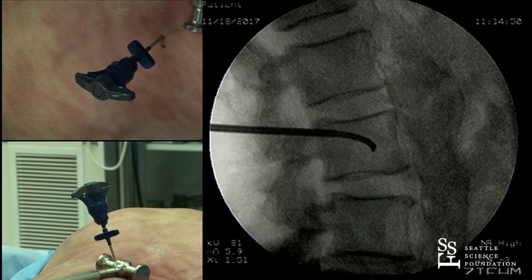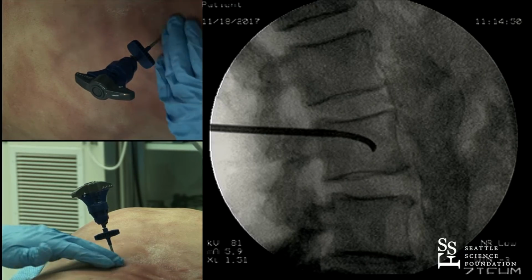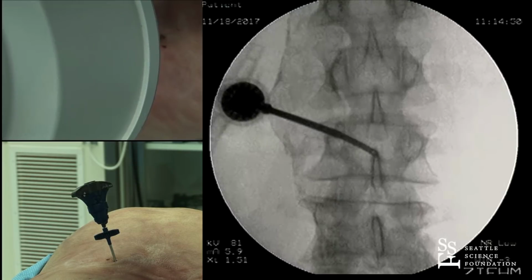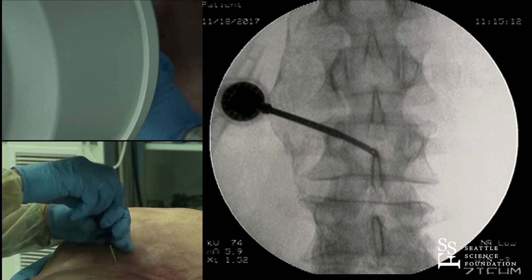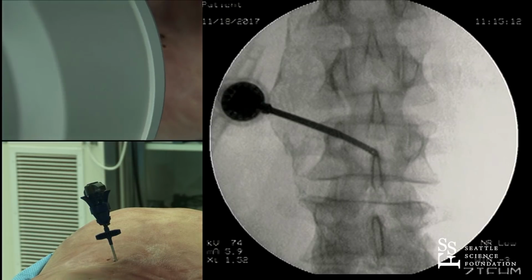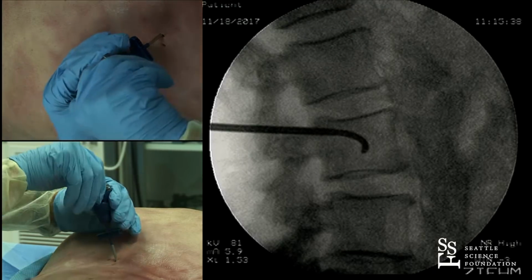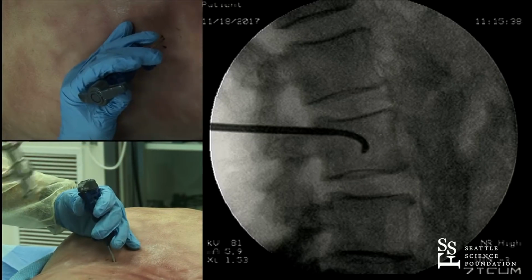So at this point in time, I think that looks very good. I'd like to take an AP shot to see where we are in the medial-lateral dimension of it. And this angle goes with the coincidence of the bevel, and it goes from ipsilateral to contralateral. And we are going a little bit from top to bottom because our entry point in the vertebral body is toward the superior side. And we see that we're directly midline here. So at this point in time, I want to get it to the contralateral portion. And so we'll go back lateral, and I put a little bit more torque on the actuator to get it to go toward the contralateral side. And this is a very nice, very powerful directional device, because we can really get toward the other side very easily. In fact, I want to take a little bit of the torque off the actuator, because that will definitely get it done.